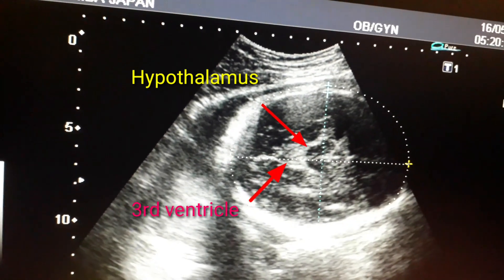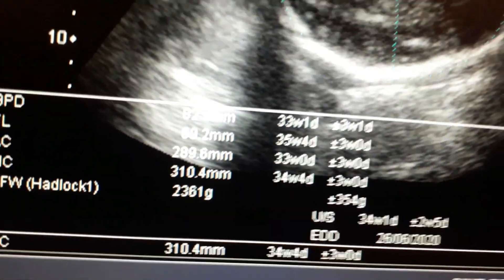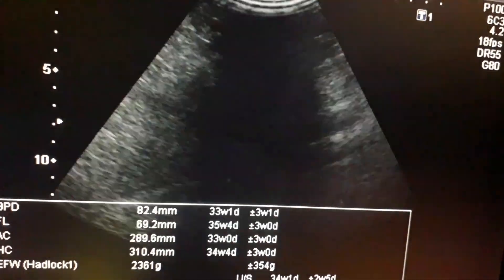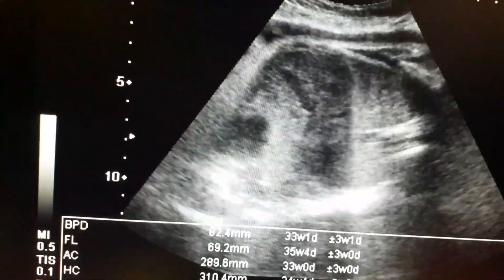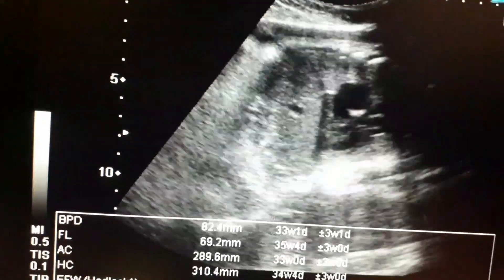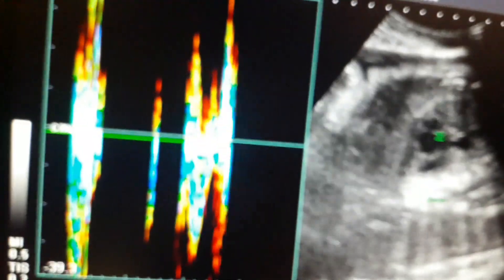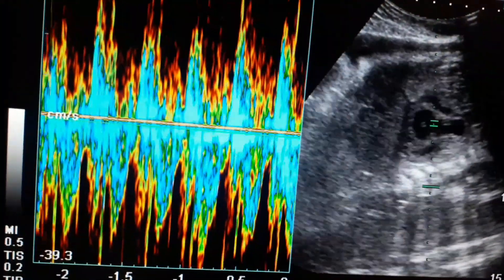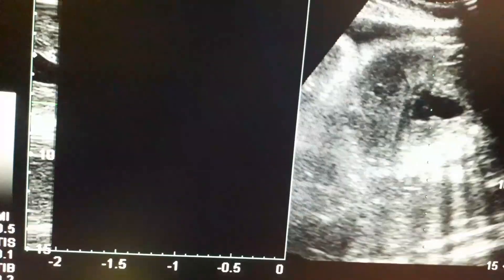You can see this is around 34 to 35 weeks. You can see the midline structure — that is the third ventricle as well as the hypothalamus.